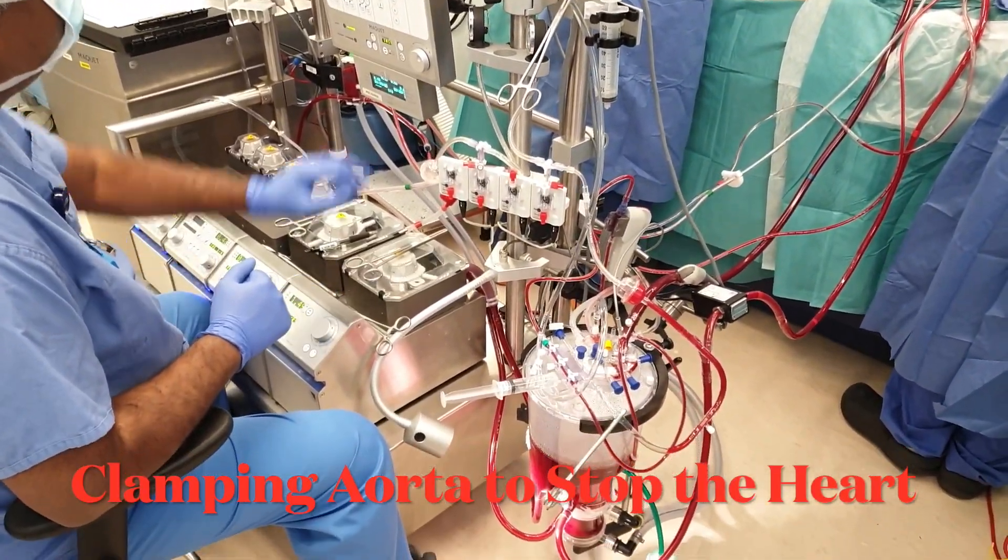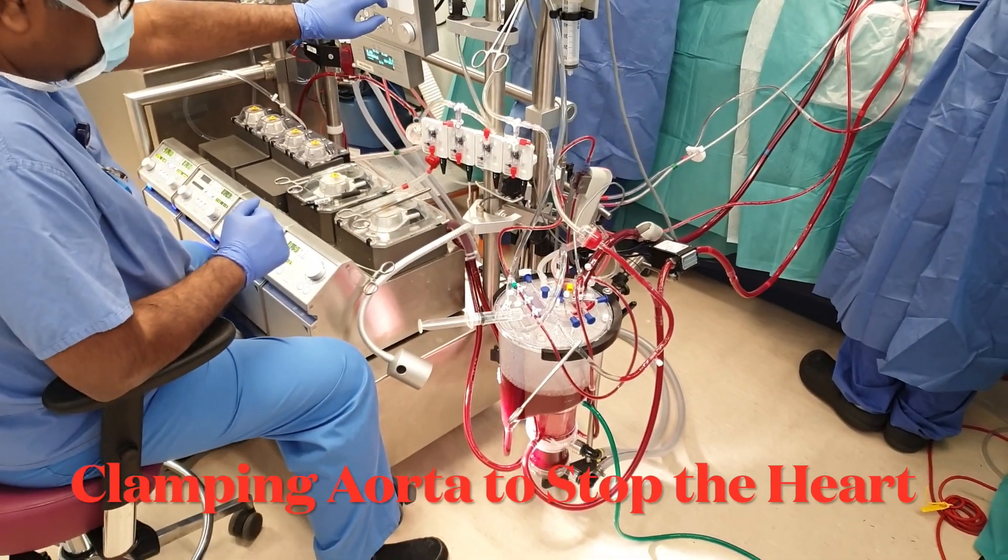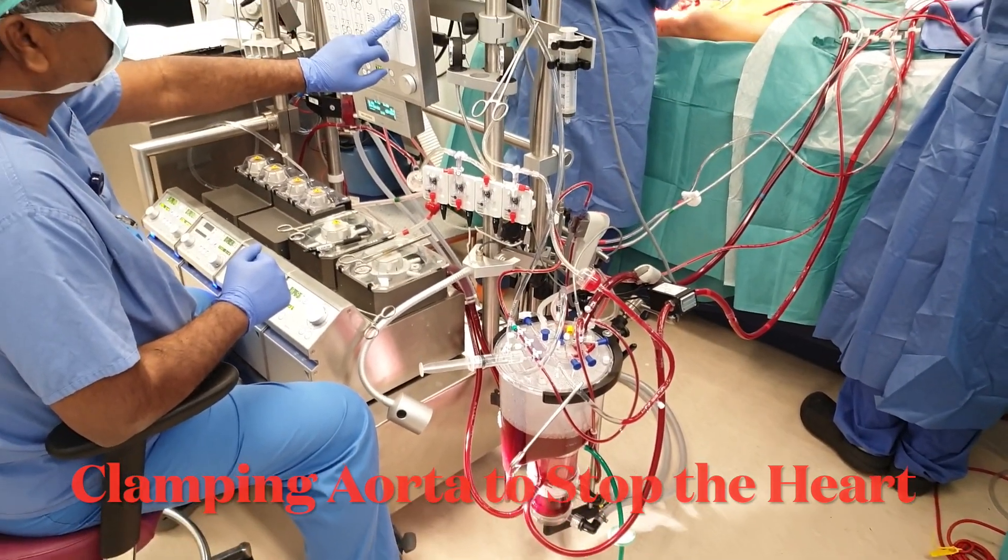Aortic cross clamp is a procedure that separates the systemic circulation from the outflow of the heart.